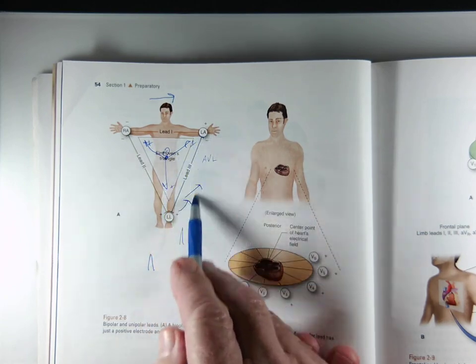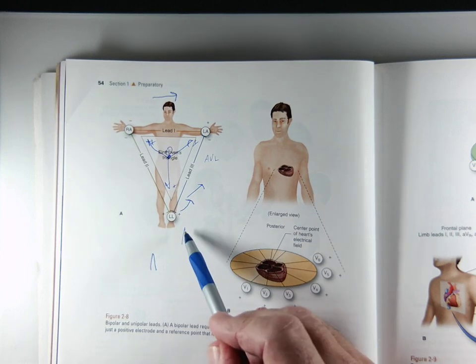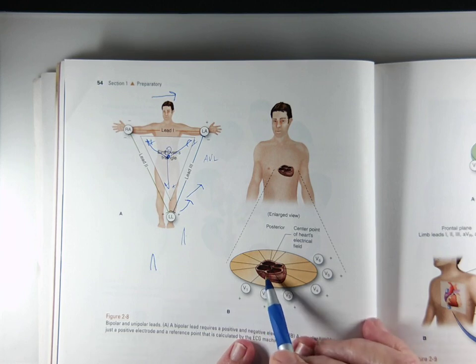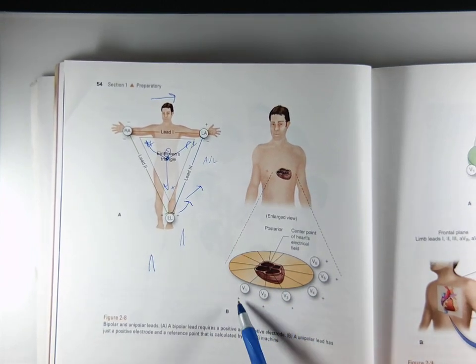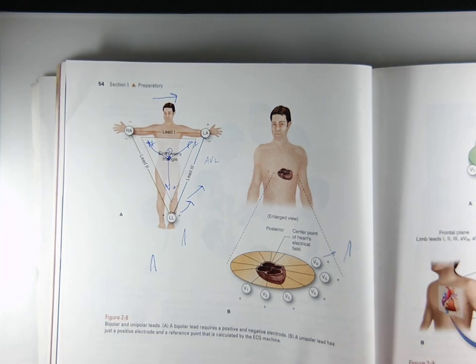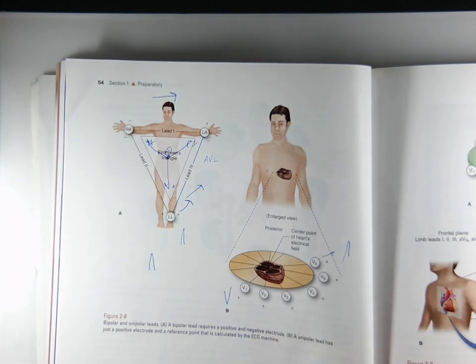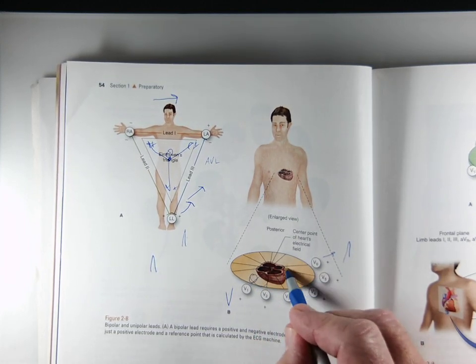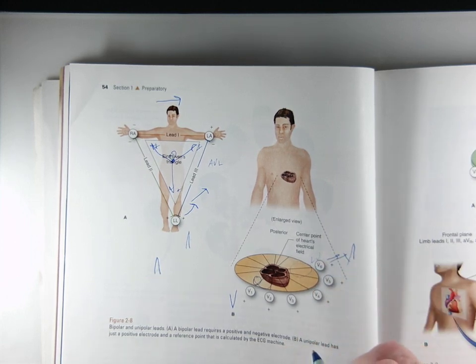Now remember, all the limb leads are on the surface of the body further away from the heart. So they usually do not have as big an R or S wave as our precordial leads, which are just sitting closer. They're just closer to the electricity, so they tend to have bigger waves. Now once again on those, as we talked about, all the precordial leads are positive. So electricity coming towards them is going to give us an R wave. Electricity going away from them is going to give the opposite. Okay? So when we have the right ventricle sitting here, and most of the muscle, the left ventricle, here, when the left ventricle fires, it's heading towards the lead, it's going to give us a nice big R wave.